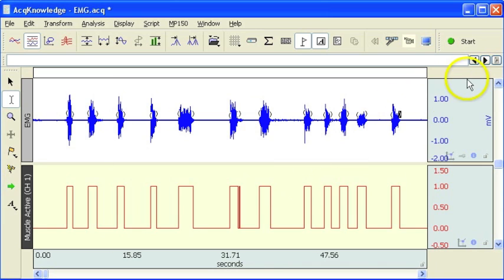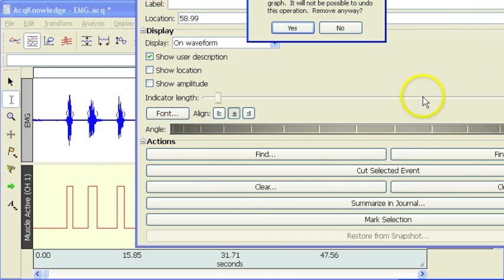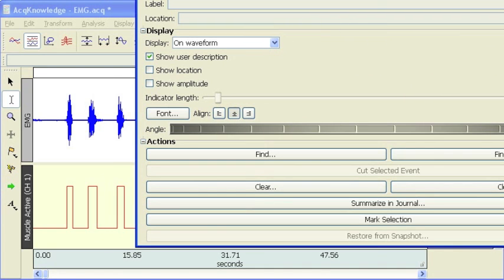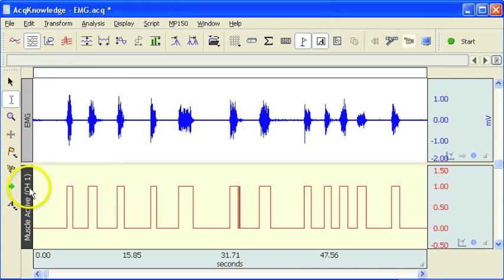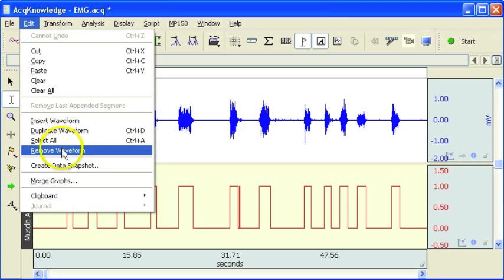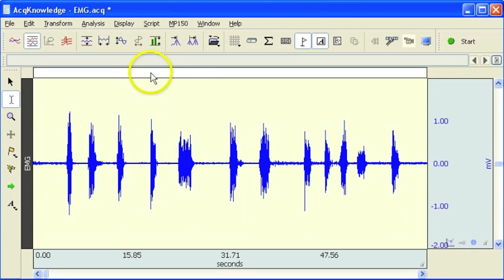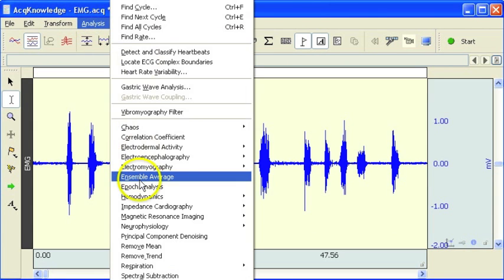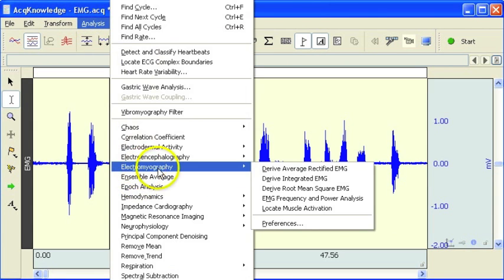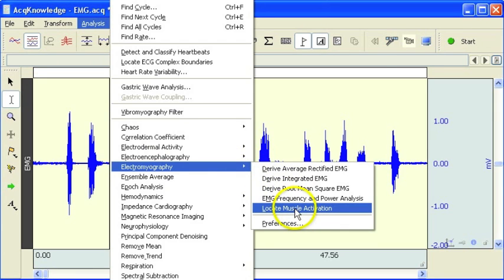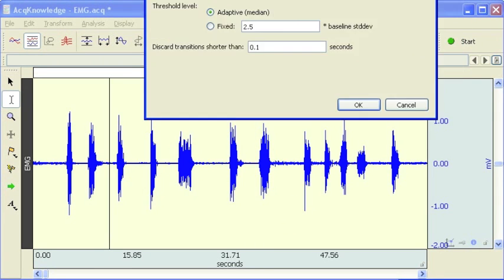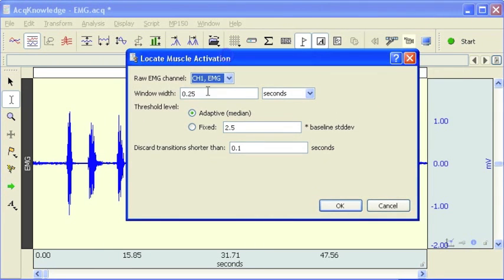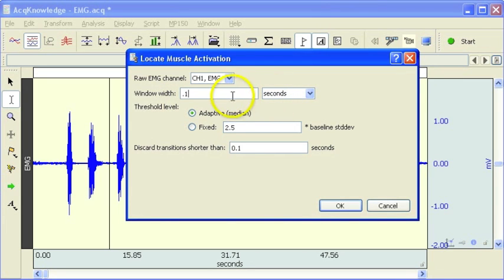What I can do is I'll rerun the analysis using the manual threshold to see if we can improve on that method. So I'll just remove the event marks and I'm going to remove this particular channel, remove waveform. I'm going to go back in to the locate muscle activation menu.